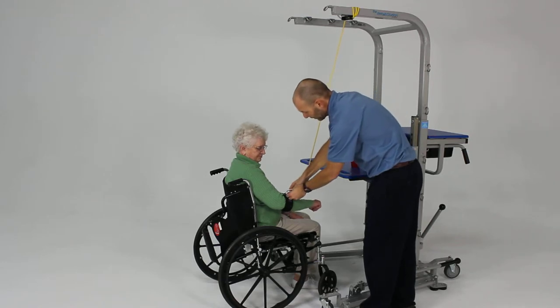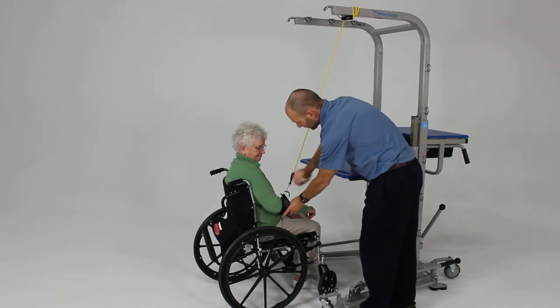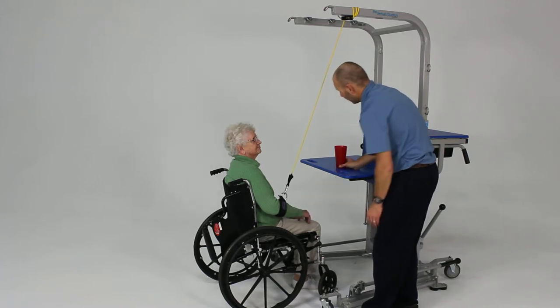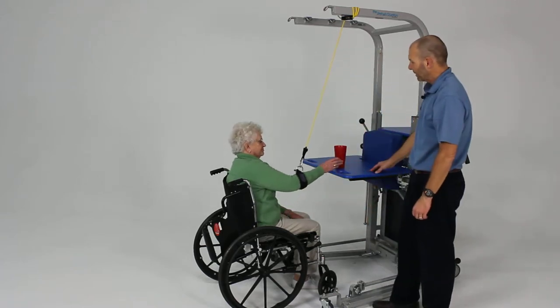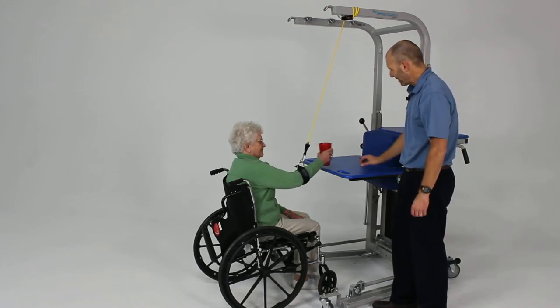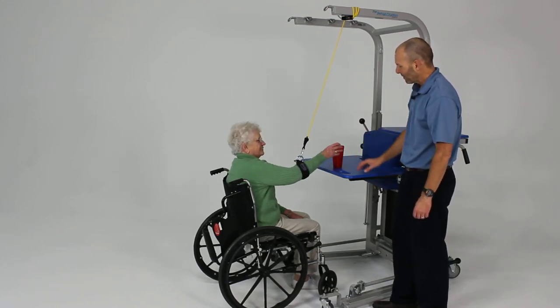In this case we're going to go ahead and clip it to the arm band and arm support, and we're going to work on some reaching activities. So what I'm going to have you do is go ahead and reach for that cup. Good. And now bring it to your mouth. Great. And place it back onto the table and put your hand back in your lap.